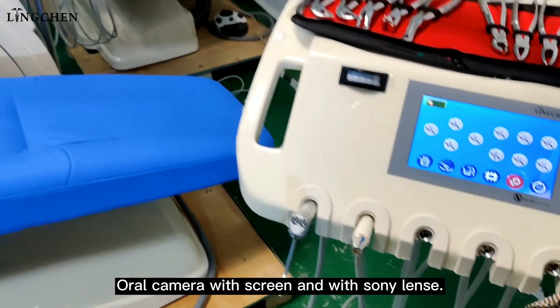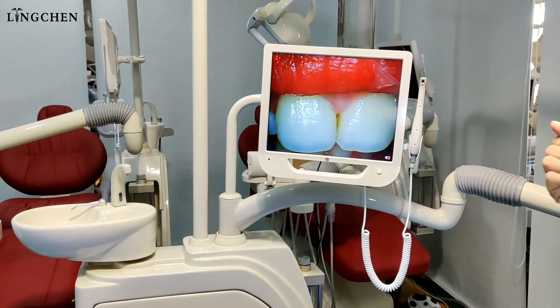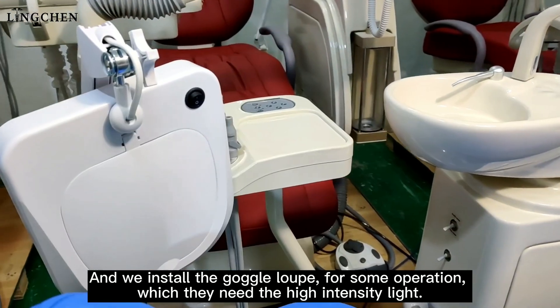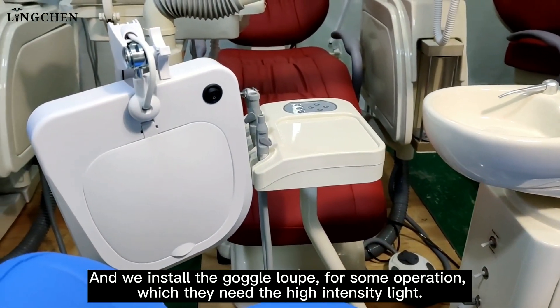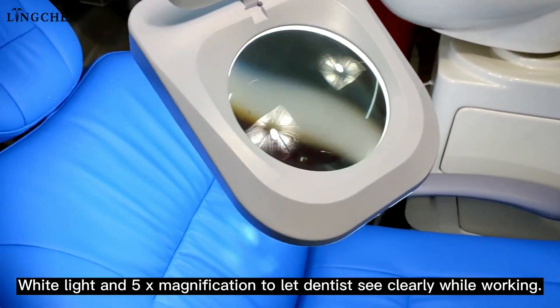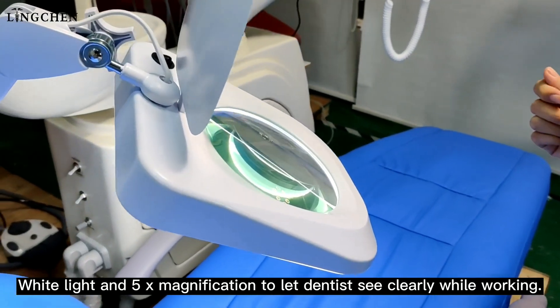An oral camera with a screen and Sony lens is installed. We also install dental loupes for operations that require high-intensity light — with white light and 5x magnification to let dentists see more clearly while working.